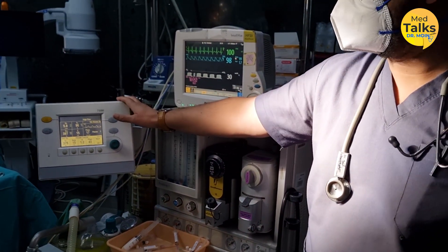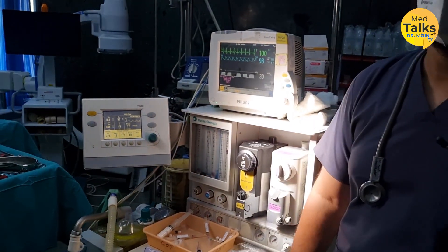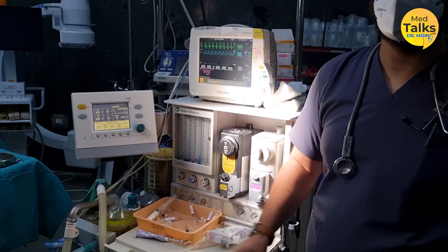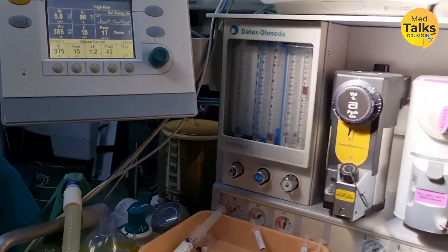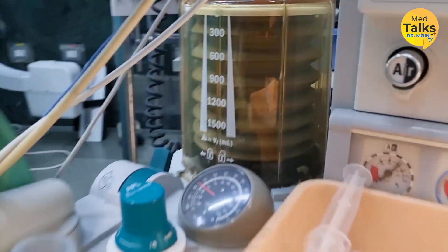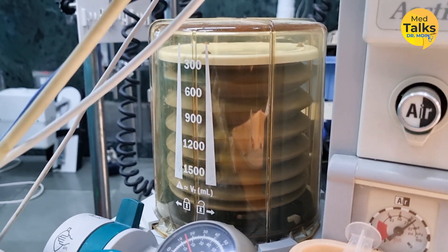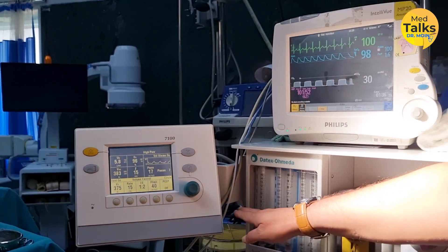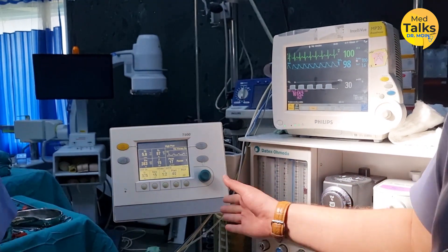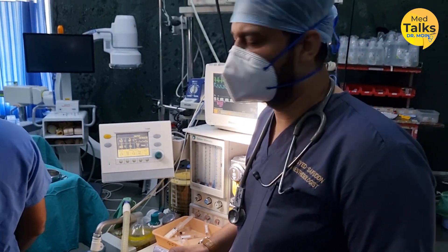When the surgery is over, we disconnect the ventilator and bring the patient out of anesthesia. I can see that something is pumping in and out here, sir. What is this? Yes, this is called the bellows. This is how the tidal volume is delivered — it pushes and gives positive airway pressure inside, providing the ventilation inside.